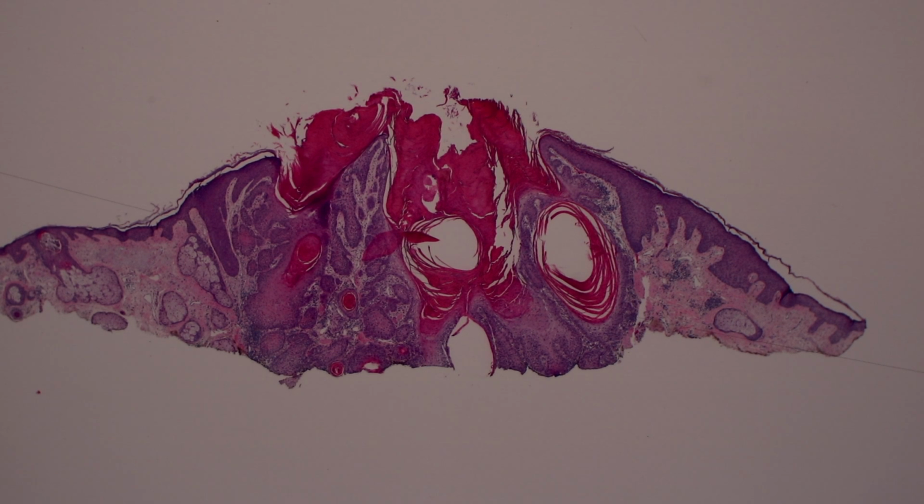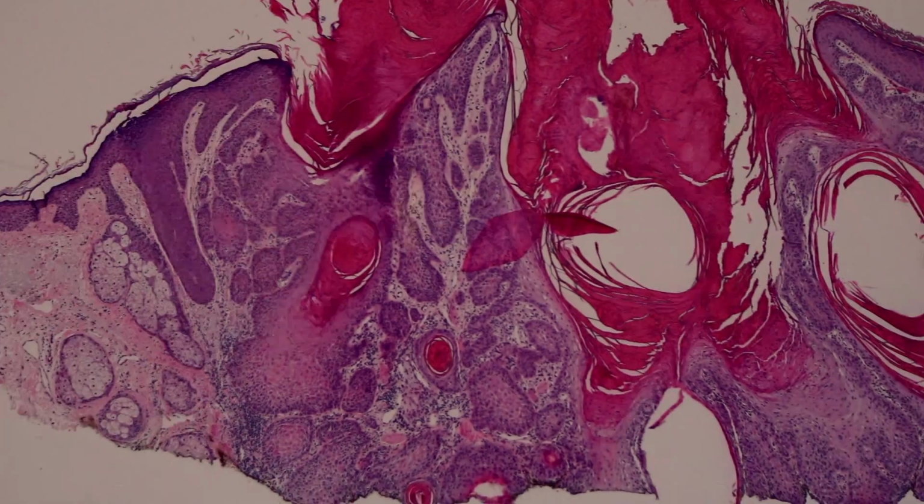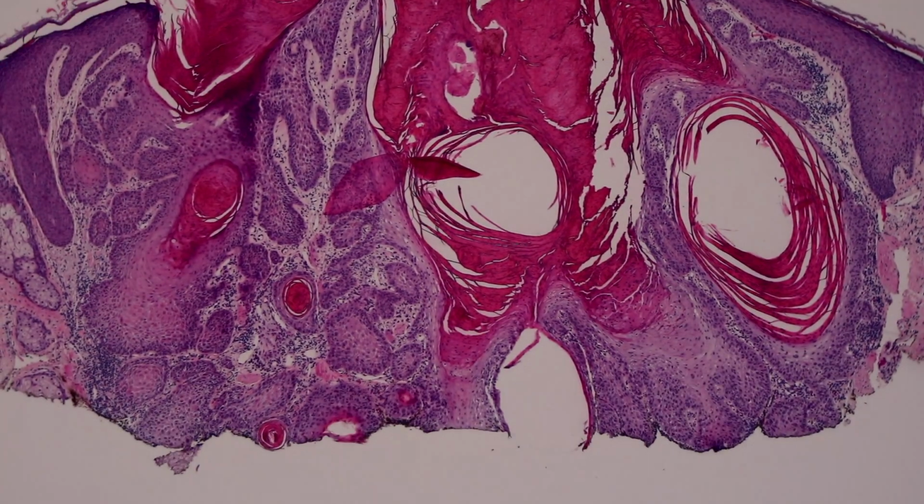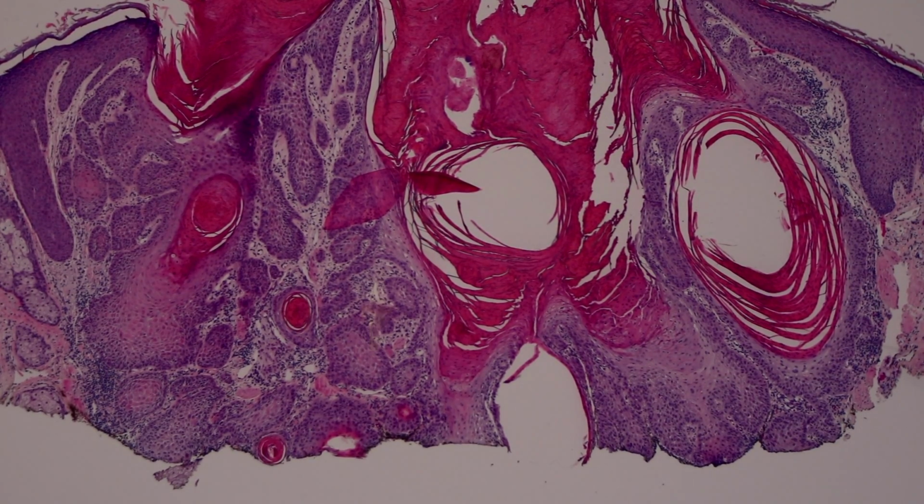And sometimes this creates an indented, crater-shaped or volcano-shaped eruption of keratin out of the skin. Down beneath this, if you had just had a superficial biopsy, it would be really hard to tell that this was squamous cell carcinoma. So on sun-damaged skin, particularly on the extremities, I'm really wary when I see an open cystic space with keratin coming out of it, even if there's not much atypia, because a lot of times that's the way squamous cell carcinomas look superficially. But when you go down deeper, you can see clearly nests of invasive squamous cell carcinoma going down into the dermis.